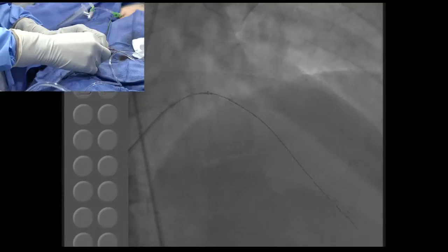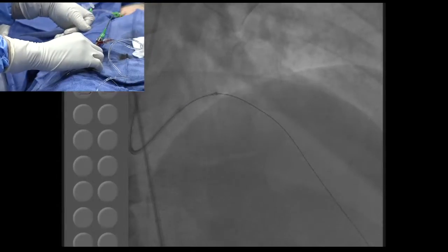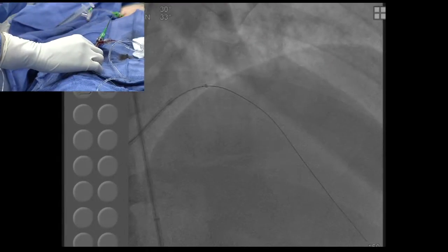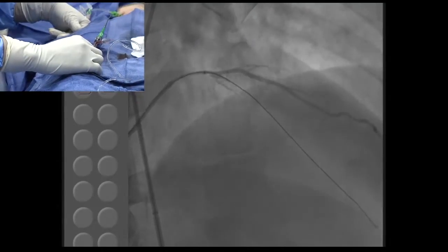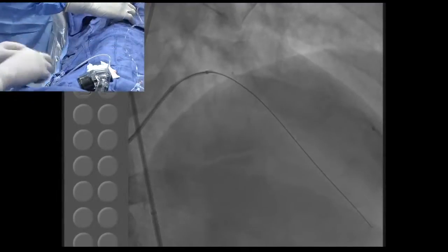I mean, some dampening will remain, but if you clearly have dampening, you want to take a picture? Take a cine. Okay. And also not to inject too hard. Slow injection, soft and slow. Good. I think we need to get this and dilate it there.